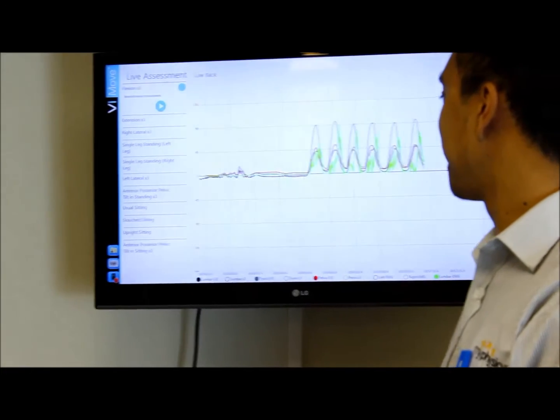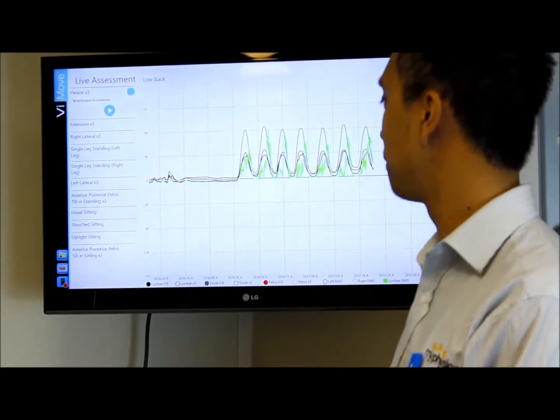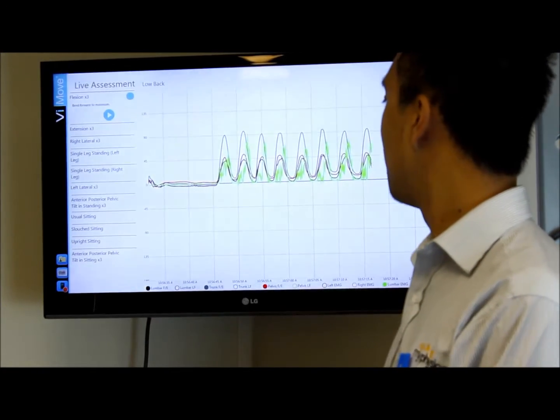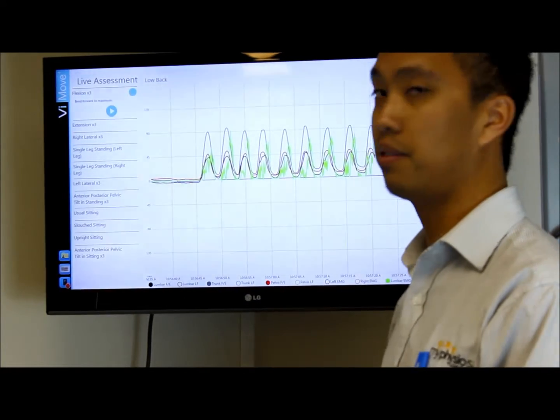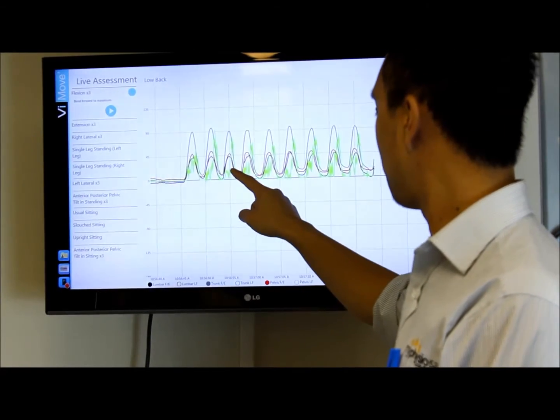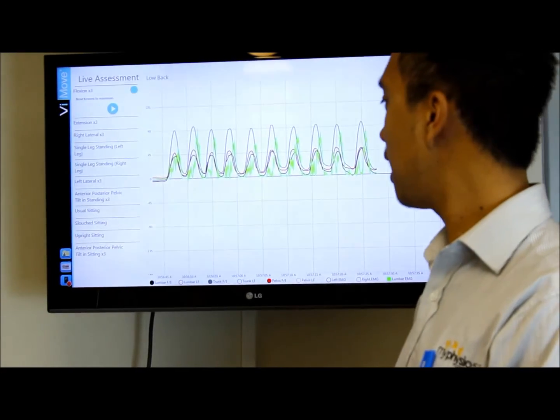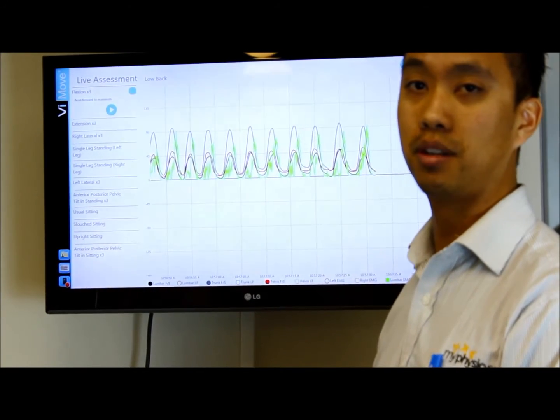As you can see from the TV screen, with our model moving backwards and forwards, you can see how much movement is happening from each of the segments. The top line is looking at how she's moving from the top of the lumbar spine, the red one is looking at how her pelvis is moving, and the green one is looking at how much muscle activity is going on in the muscles in the back.